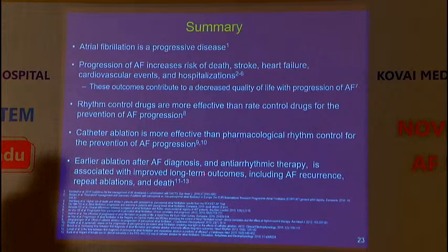So earlier ablation after AF diagnosis and antiarrhythmic therapy is associated with improved long-term outcomes, including AF recurrence, repeat ablations and death.